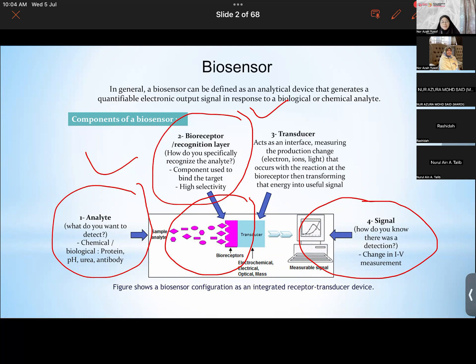which will not be in this lecture, because it has to be done via standard techniques, using SPR, using ITC, which are not discussed in this lecture.